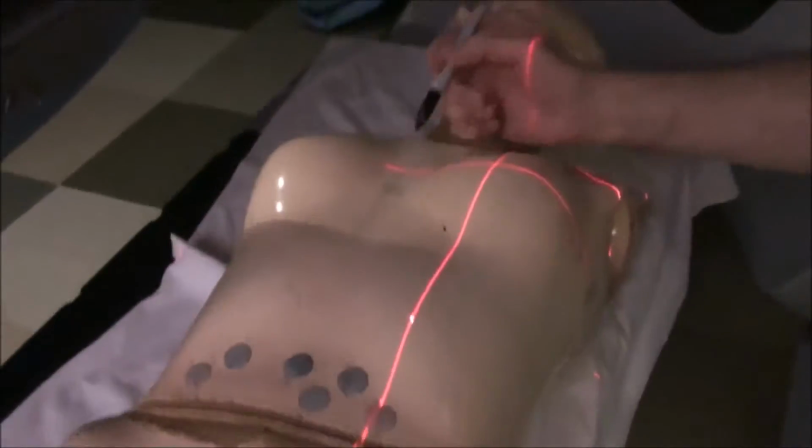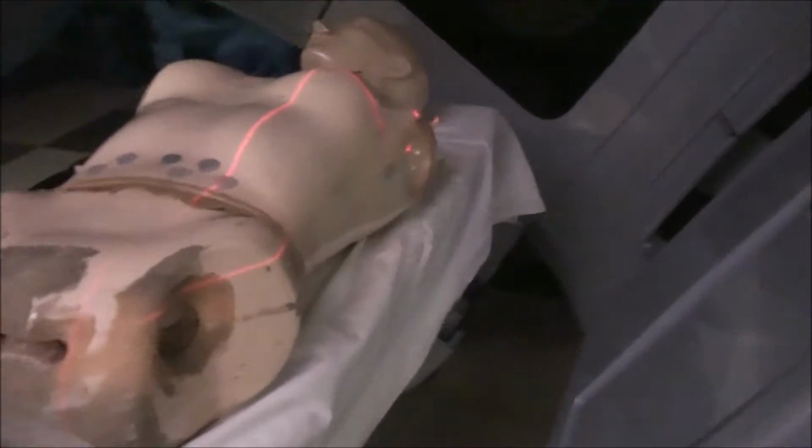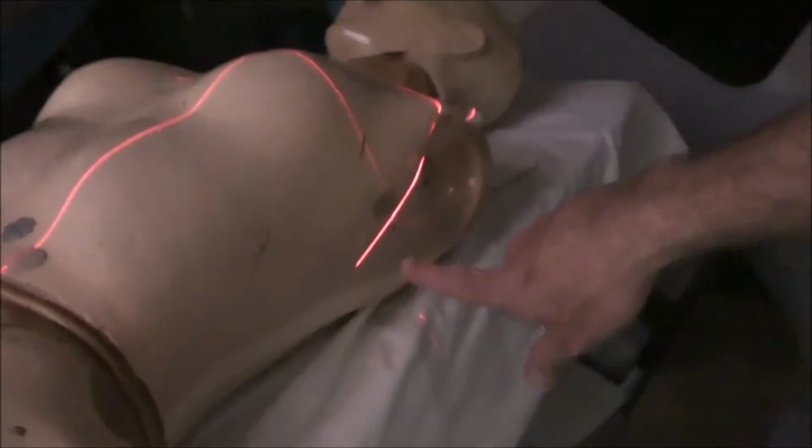So I'm going to go ahead and put some marks on the patient, and we're going to pretend that I was exactly right. The doctor said, right about there, right about there. So he just put some marks on. Right there. I've got the image intensifier in the way. Let me move the eye a little bit so we can actually see our back pointer laser. Okay. Back pointer's coming across here.